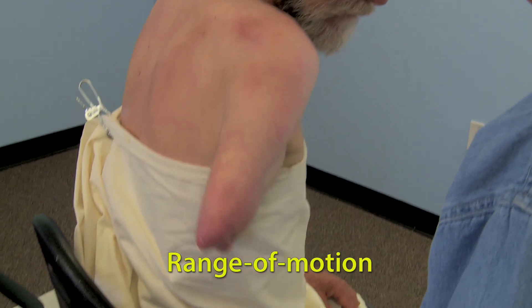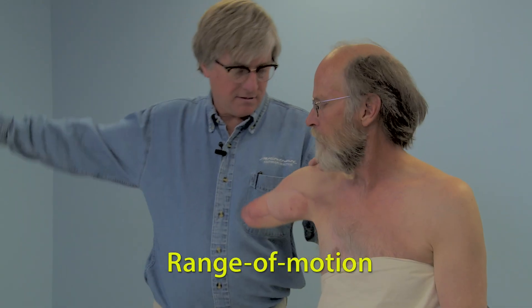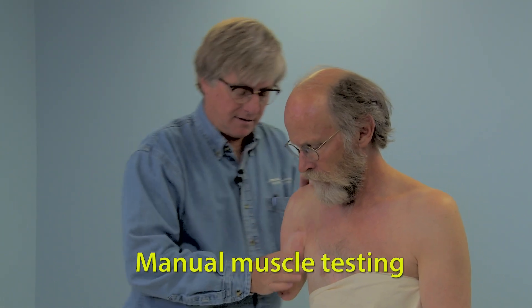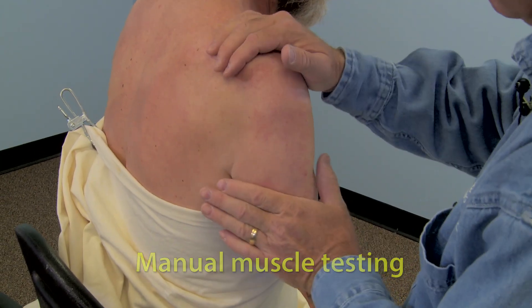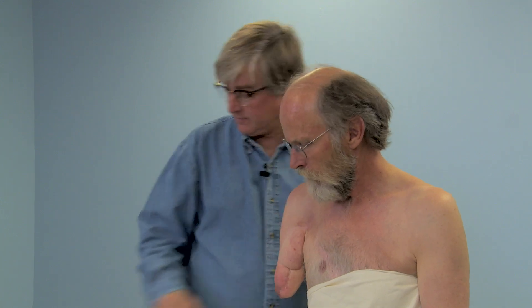Test and measure the patient's range of motion, and perform manual muscle testing to determine the strength of the patient's glenohumeral joint. Note these findings.